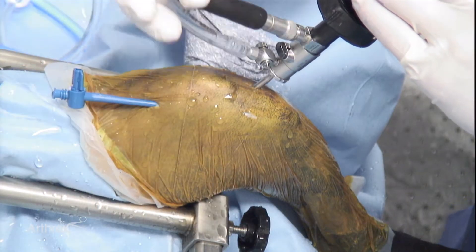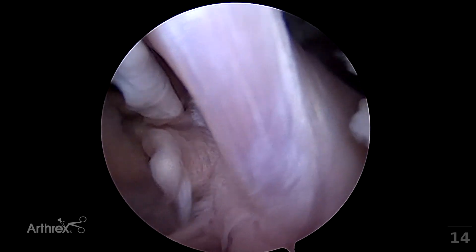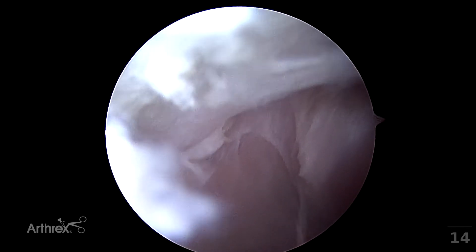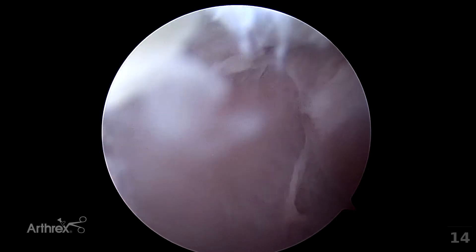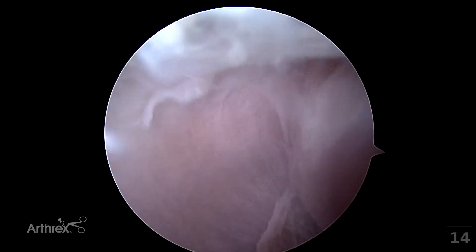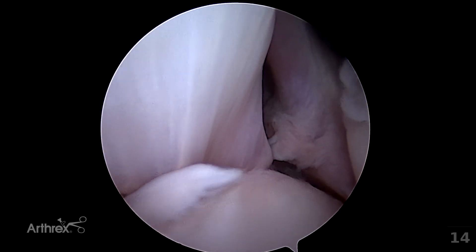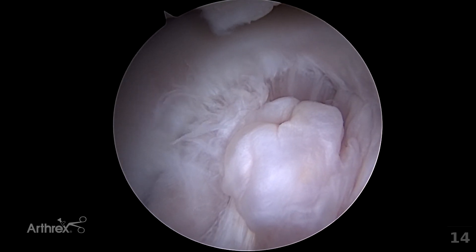By retracting out from this space gently using the light post and scope control, it is now possible to move past the lateral meniscal ligament and insert into the lateral compartment. In this location, using the post, we can visualize the lateral fabella surface. Use of the post and the 30 degree offset is crucial to perform this process. The lateral fabella can be seen in the caudal compartment of the joint. Moving back out of the notch, the caudal cruciate can be assessed — both the insertion of the caudal cruciate on the tibia and the origin of the caudal cruciate in the femoral notch can be evaluated.